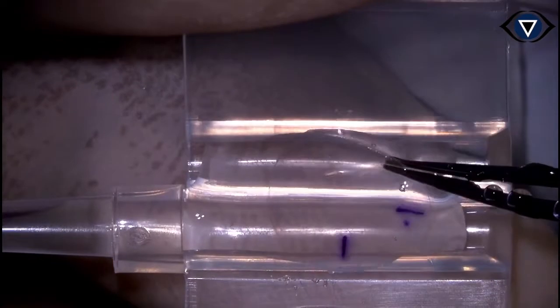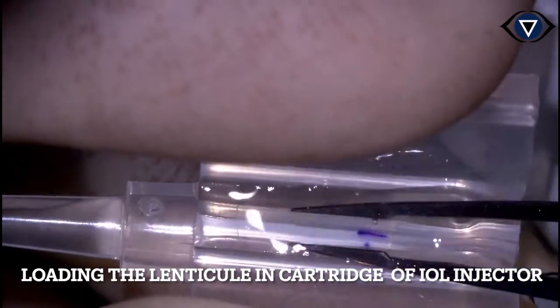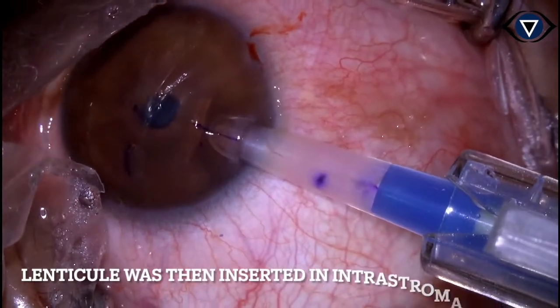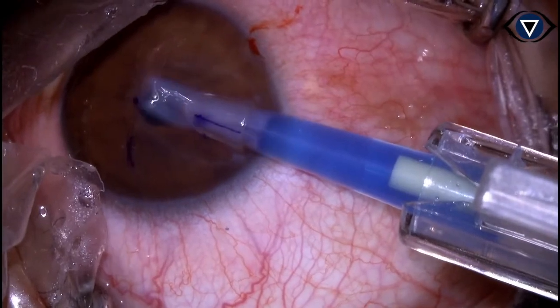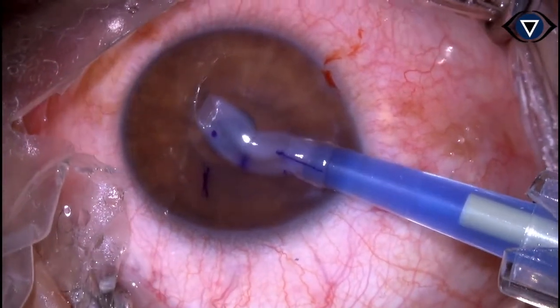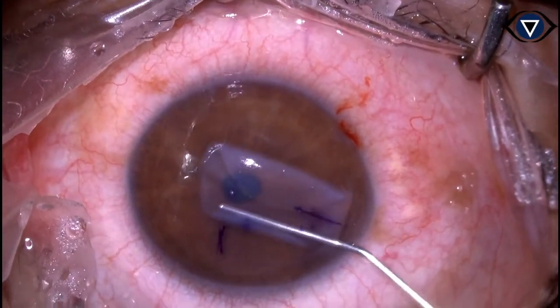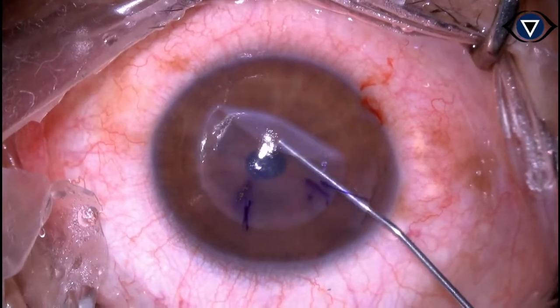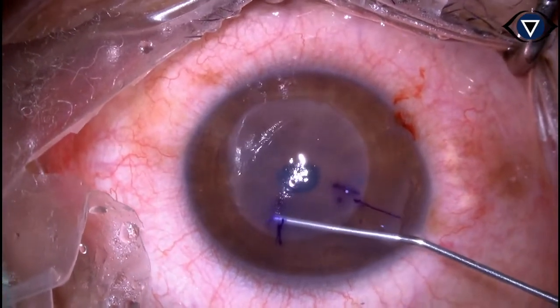Now the lenticule was loaded in the cartridge of the IOL injector with stromal side up. The lenticule was then gently inserted in the intrastromal pocket. The lenticule was then unfolded and adjusted according to the markings present for correct orientation.